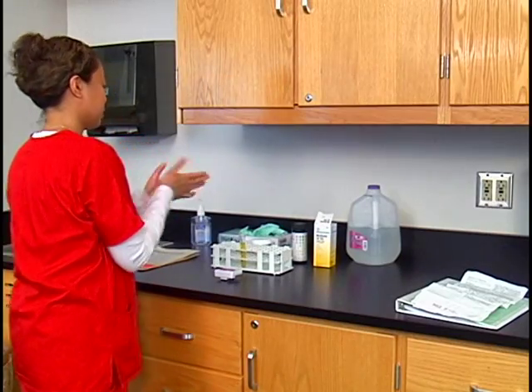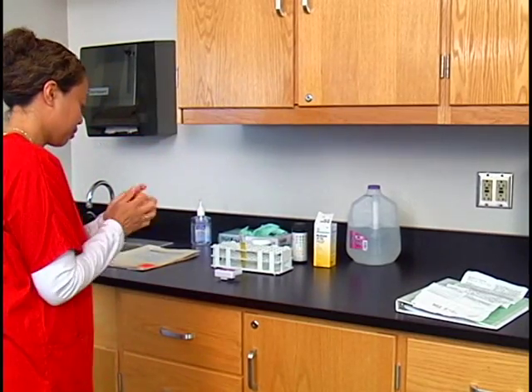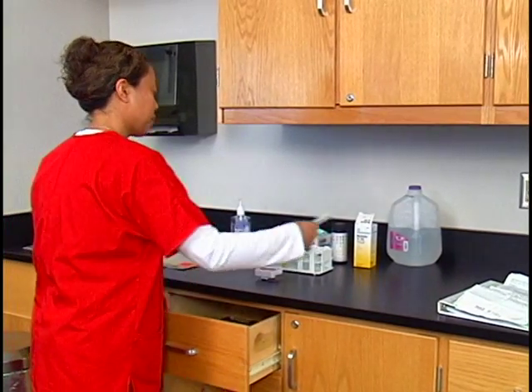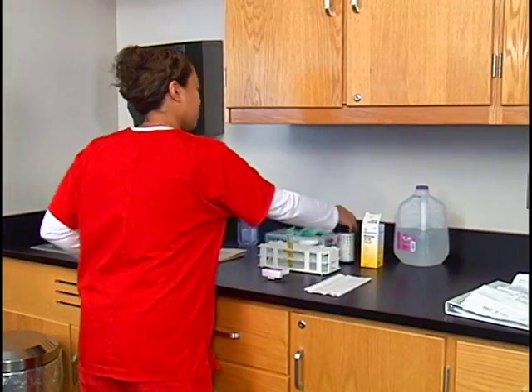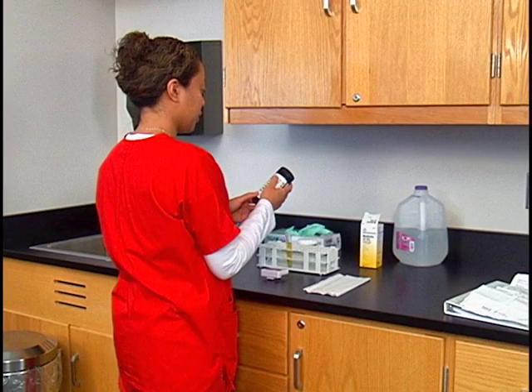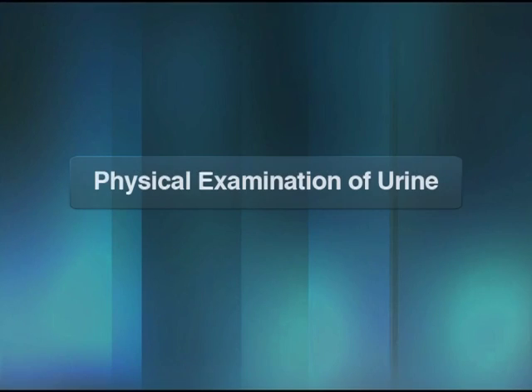Sanitize your hands. Assemble the equipment. You will need the Multisticks 10 SG reagent strips, a paper towel, and a timer. Check the expiration date of the reagent strips. Outdated reagent strips may lead to inaccurate test results. The physical examination of the urine is performed first.